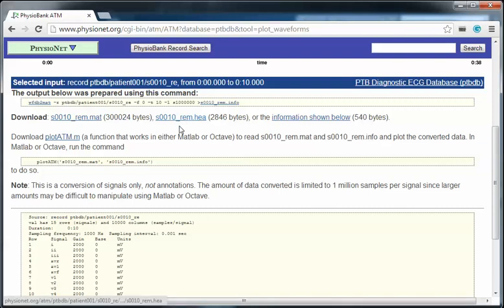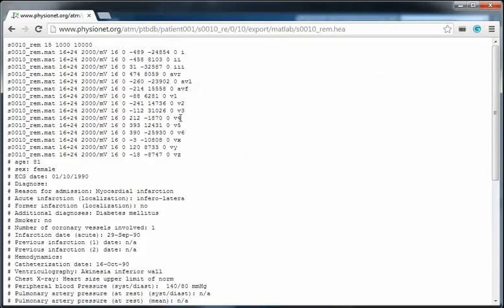Let's talk about the second file. This file is a text file which represents some more detail about the record we selected. For example, this record belongs to a female who is 81 years old and the reason for admission is myocardial infarction.